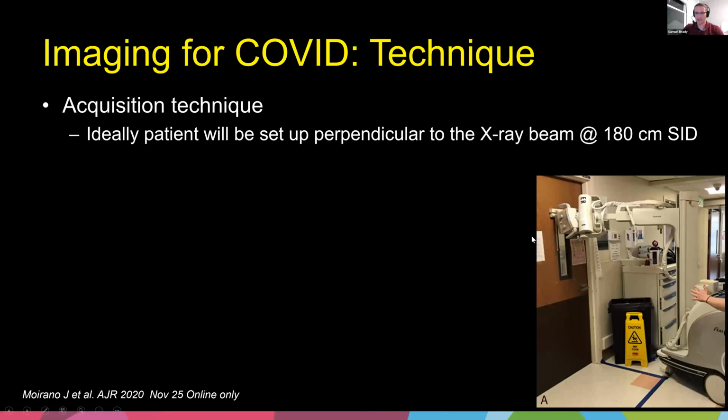In this case, this door has a very small glass window, and a patient is not going to be that tall. At best, if they're standing, they're going to be shorter, so you're going to still have to come at an angle. At worst, they're going to be sitting on a table or on a stretcher, or they're going to be in a wheelchair. And so your angles now are not perpendicular. You're coming in at this weird angle.